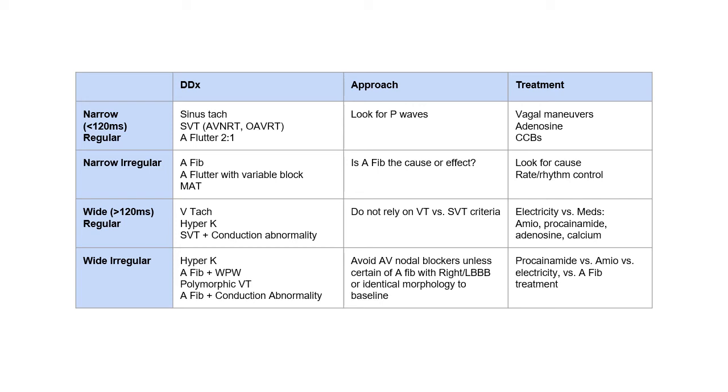There's also something called multifocal atrial tachycardia, where the pacemaker is coming from different foci in the atrium, and so you get this pretty unique rhythm. Well, I think I have an example that we'll look at.